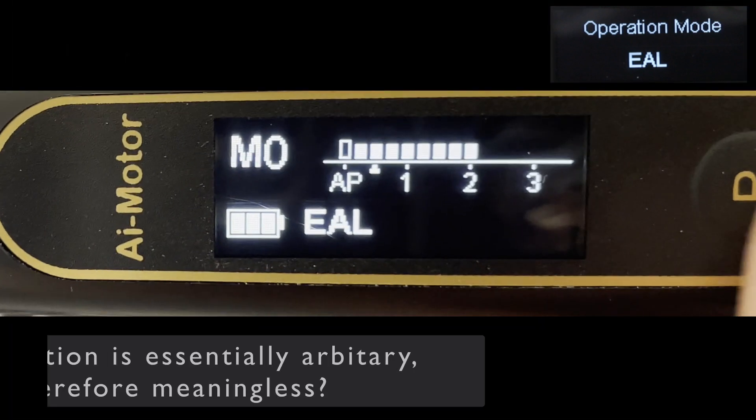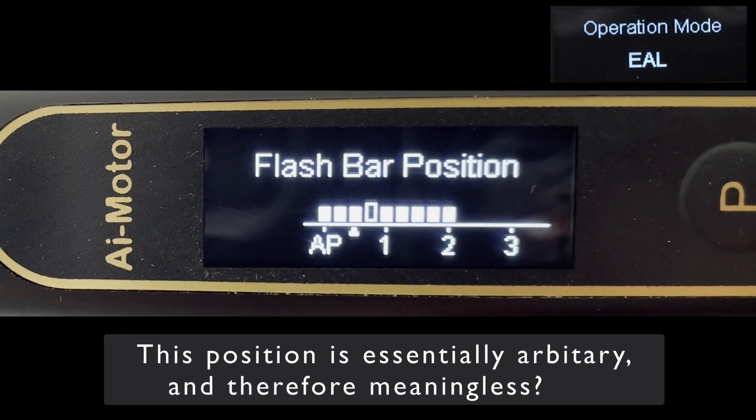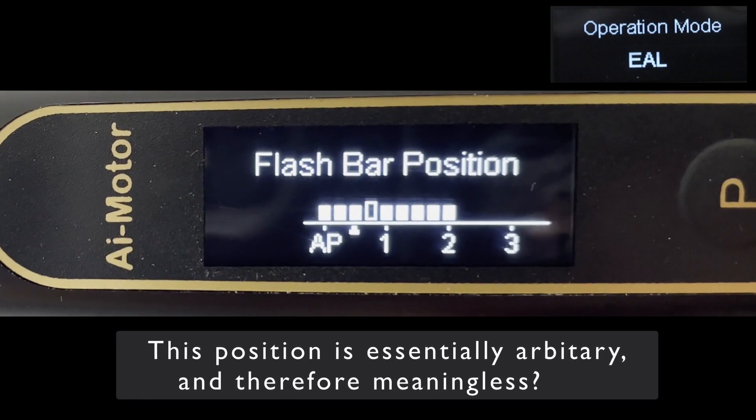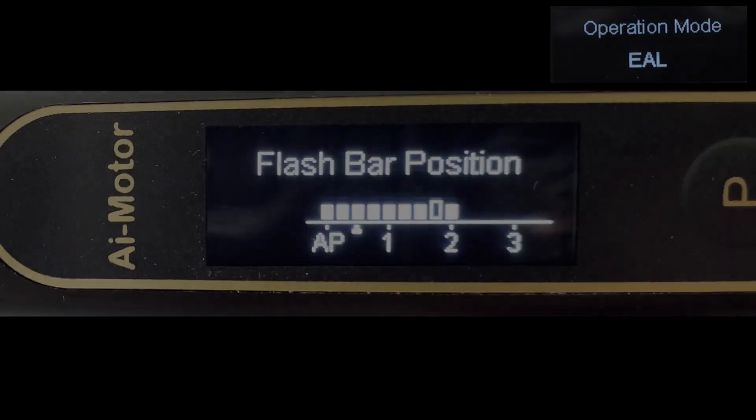There is a mode that can be used with the Apex Locator called the Flash Bar Position, and when set, it will activate at different positions. As this measurement is completely arbitrary, I wonder if this mode is actually useful.